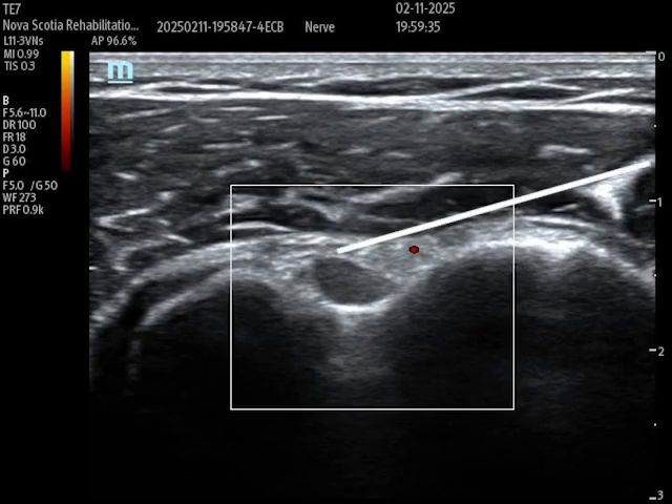When I guide my needle — using that white line as a reference — I'm guiding it above the artery, superior and medial to the biceps tendon. With the injection, I like toggling the probe to make the tendon more anechoic through anisotropy so it's very apparent. That's generally how I would approach things.